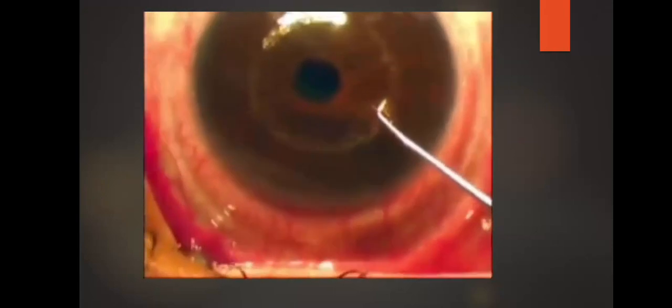Then we open the incision site to ensure easy entry for Kera ring segments. We try to dilate the entry on both sides to ensure easy ring segment implantation. Here we can notice that we use the first ring implantation in the wound and its entry is easy. Then we introduce it deeply through the tunnel.